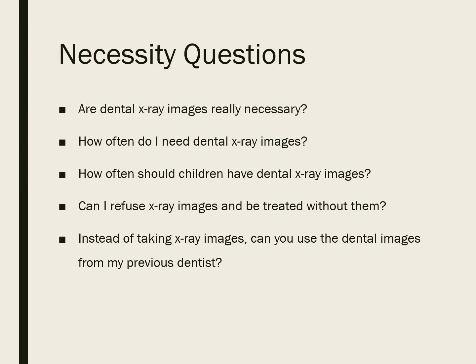Most diseases and conditions such as tooth decay, gum disease, cysts, and tumors cannot be detected simply by looking into your mouth. Many diseases and conditions produce no signs or symptoms. Without radiographs, these conditions would go unnoticed. It's also important to note that we will be able to detect these diseases early in their stages, and we can hopefully prevent the further spread of any of these diseases that might cause pain or any kinds of further problems. And so the short answer is yes, dental x-ray images really are necessary.